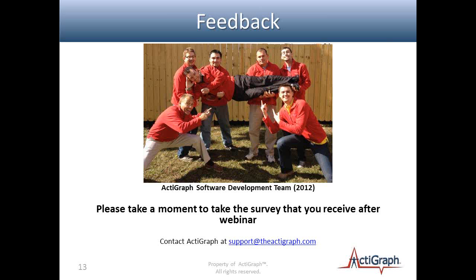So Neil Glover asks, is there any plan for allowing user formatting of reports? That is something we're actively aware of, and we know that most of our reports currently are PDFs. We have some things in the works to make them either Word formatting or RTF format, so that way you have access to that and can quickly add your notes. We'll have a section for notes and diagnosis, all that information.